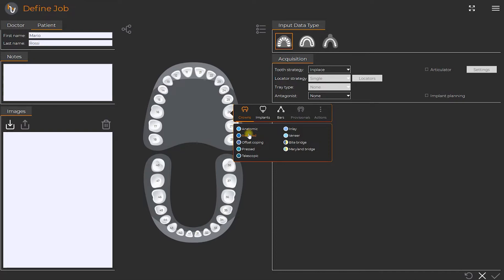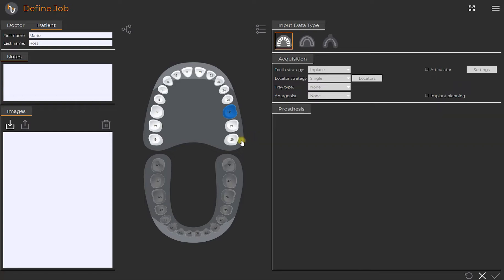We click on crowns and reduced. By clicking again we confirm the extension of the single tooth. Then we select the tooth 26 to create a single element.